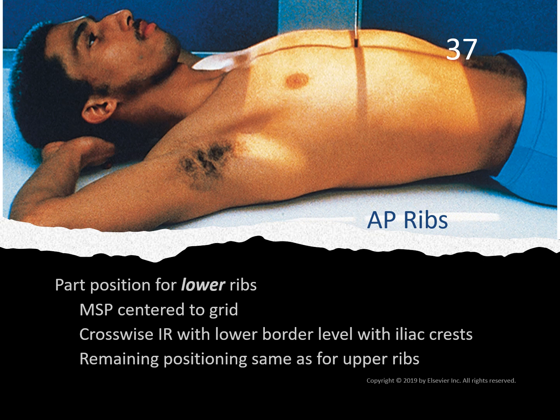The chest x-ray, remember our kV is 120 for that. No, that's for penetrating through the ribs and making the ribs appear transparent or glass-like. We want the opposite of that because we're not looking at lung tissue, we're looking at ribs. And so we want low kV to stimulate photoelectric absorption rather than overpenetration. So we want to drop our kV. Typically I did mine at like 66 to 68, maybe 72 for a hypersthenic habitus. But most of my sthenic patients, 66 or 68, depending upon what the machine allows.